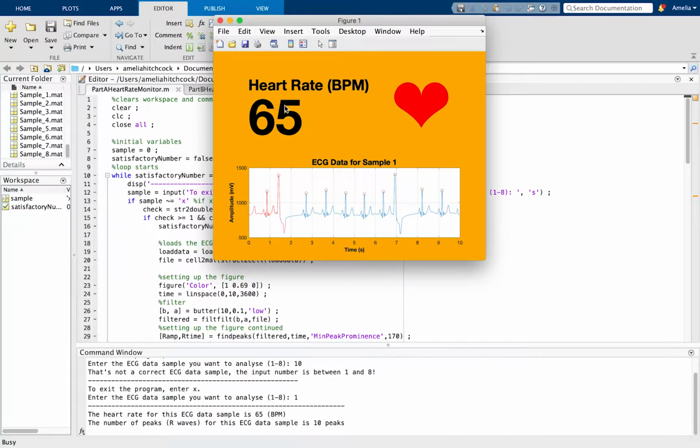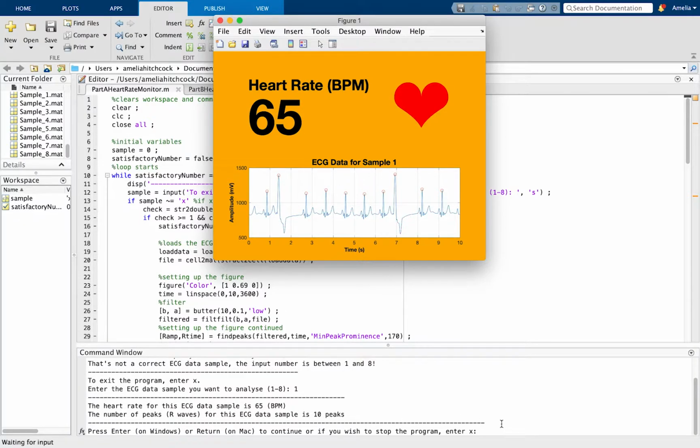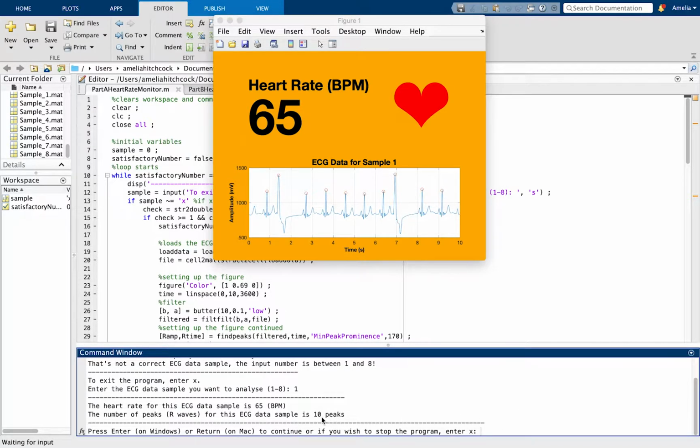It brings up a figure and it shows you what the BPM is in black, and it also shows you an animation of a beating heart that beats every time it hits an R wave. It also shows you an animation of the red line tracing the graph, and when it gets to the end of the graph, it asks if you want to continue or if you want to exit, and that will happen right about now. Okay, so if we want to continue, press enter, and if we want to exit, we press X. I'm going to continue.